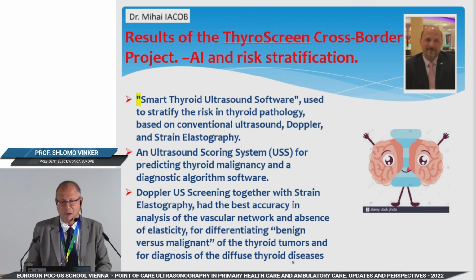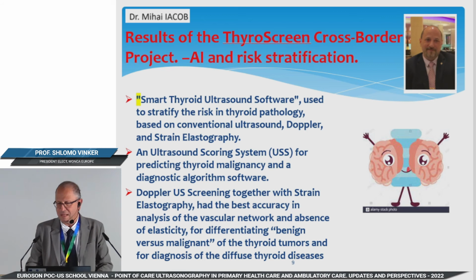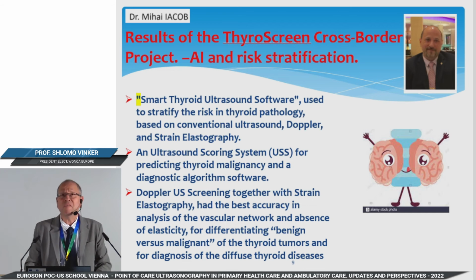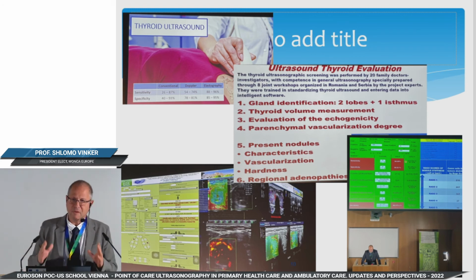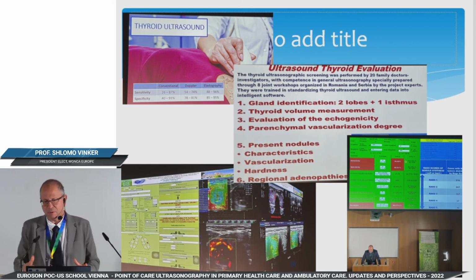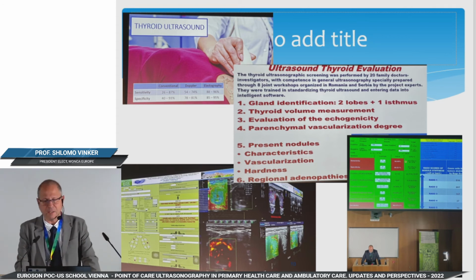We talked about research in thyroid ultrasound, a new software that helps you to make the right decisions, and also, again, a very complicated issue that will take time before it will be relevant to most family doctors. But we try to organize it in a very systematic way of how to do the test and how to report the results, and maybe to use an artificial intelligence or an algorithm to give us a more precise direction to the diagnosis.